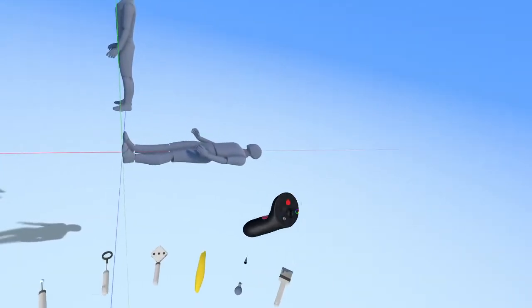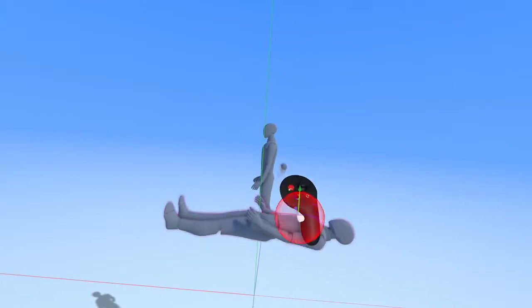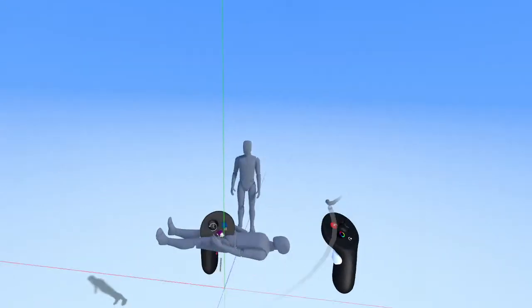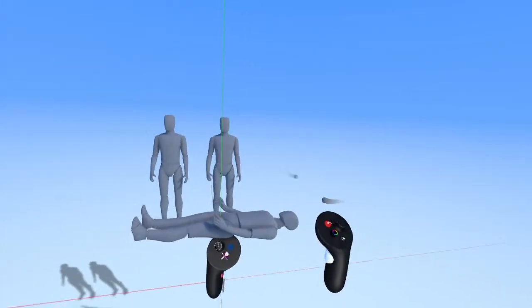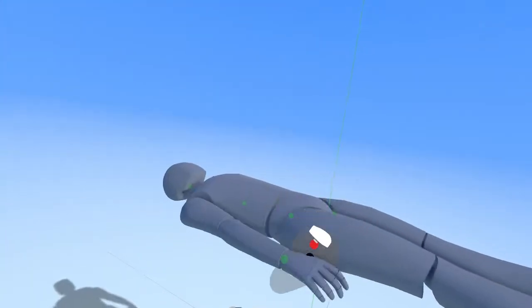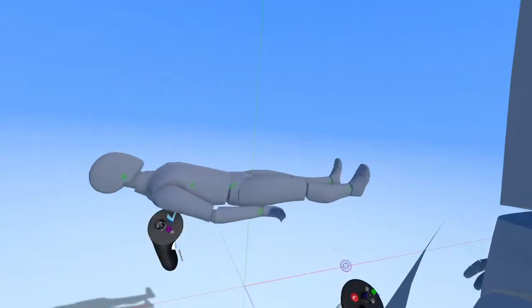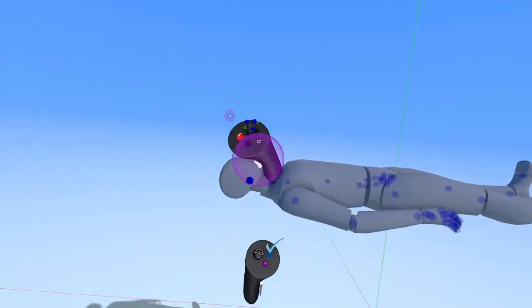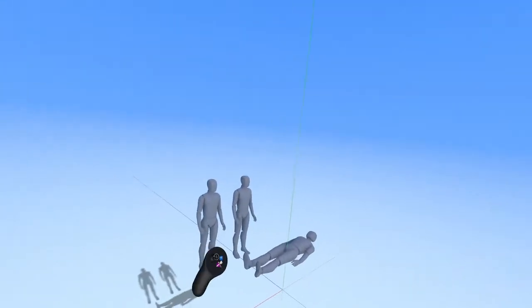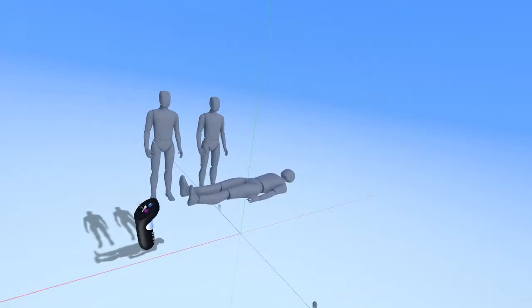I'm going to delete this guy and then swipe across my body and get rid of the tool belt. So great, now we have somebody standing in for our doctor. Actually, I'll just rotate the doctor like that. Can duplicate this out for a nurse. And then we have our patient here on the table. And again, we could put this into edit mode and move the arms so that they're like this, maybe even grab the body and tilt it up a little bit like that. Yeah, that's probably too much. Okay, cool. So now we have our context here, our people, and we can start designing around this.